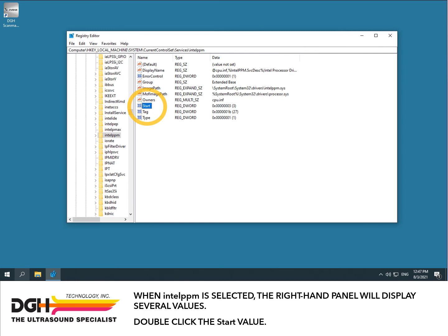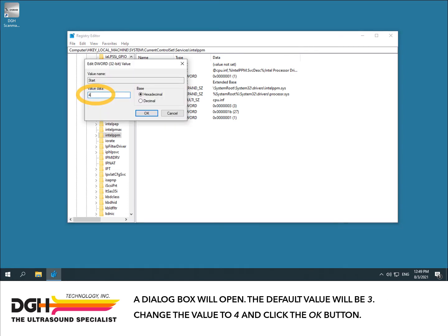Double-click the Start value. The dialog box will open. The default value will be 3. Change the value to 4 and click the OK button.